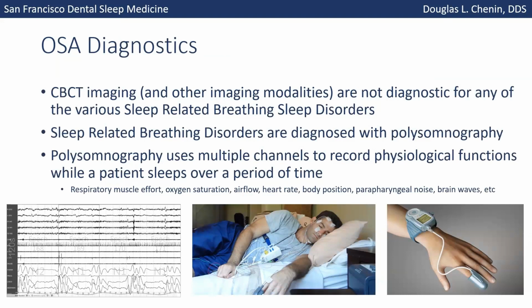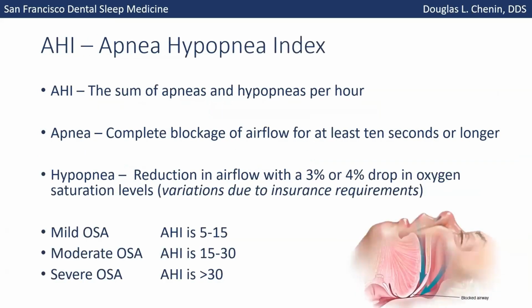And so I'm not advocating using cone beam imaging as a substitute or as anything other than a tool that can really help you understand the complete anatomy and ramifications of what's happening in a patient's physiology to help treat them, because it can be multifactorial. So the sleep study is needed. And this is where I'm going to start. I'm going to go a little bit fast.